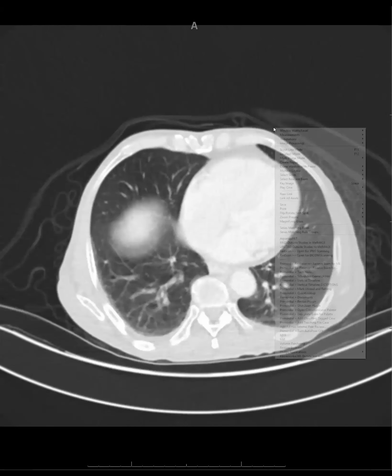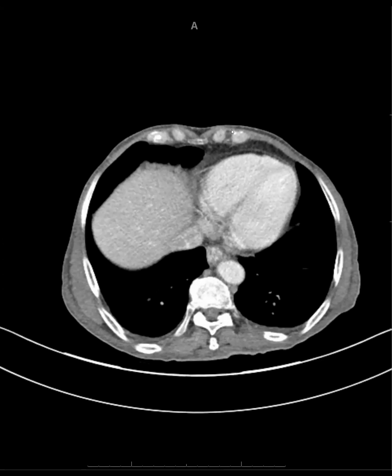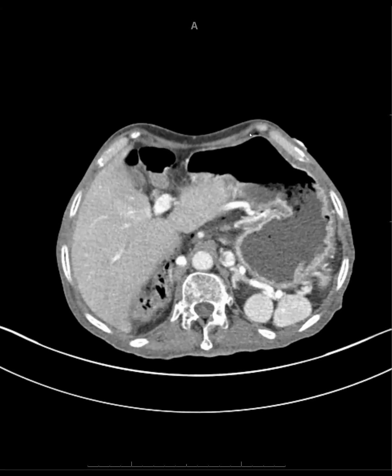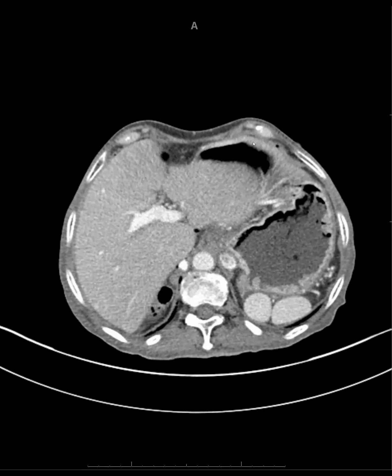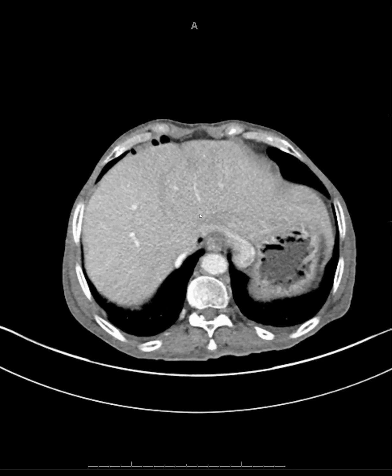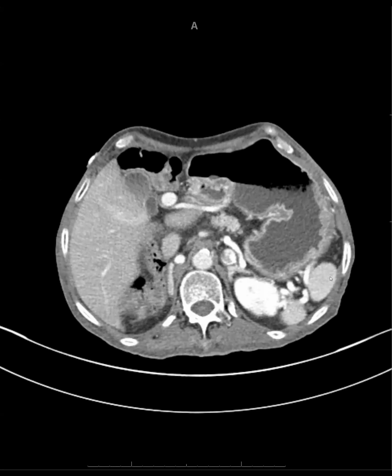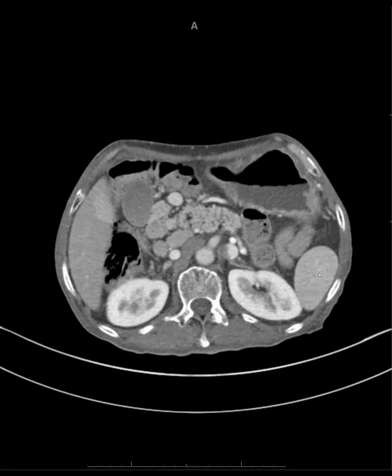So this gentleman is in his 70s, and he presented to our GI group with just generalized abdominal pain. And we're going to pass over the little bit of free air that we see. I'm not sure if I should just describe findings and have you guys tell me what you think, or I can just scroll and show, take a look at the spleen, or the multiple spleens.